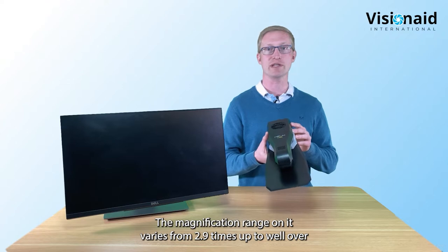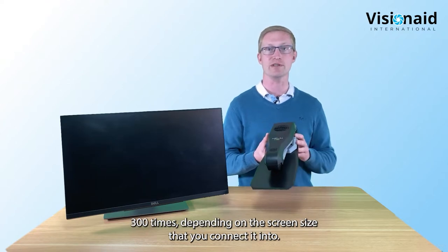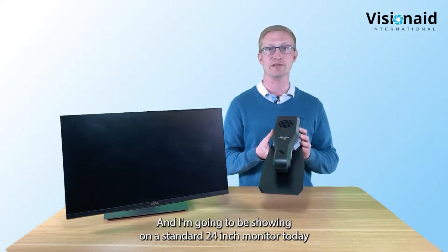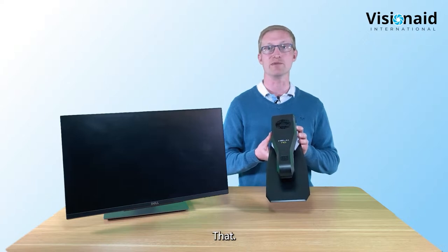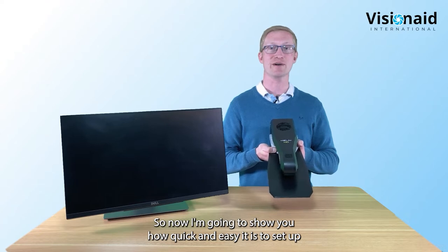The magnification range varies from 2.9 times up to well over 300 times, depending on the screen size you connect into. I'm going to be showing on a standard 24-inch monitor today where it goes from 2.9 times up to 135 times. Now I'm going to show you how quick and easy it is to set up.